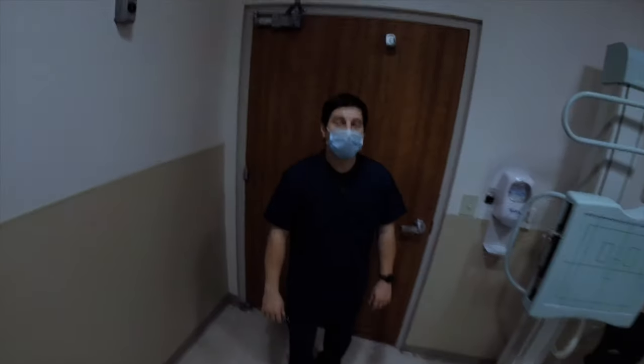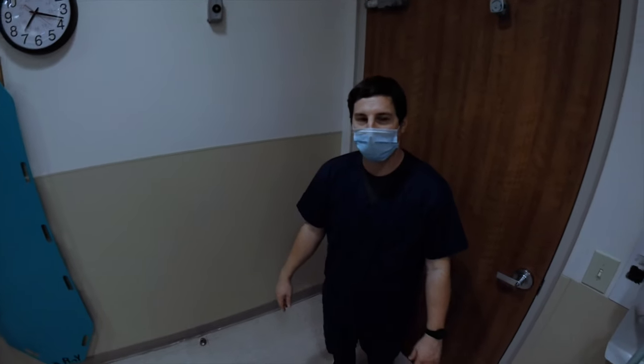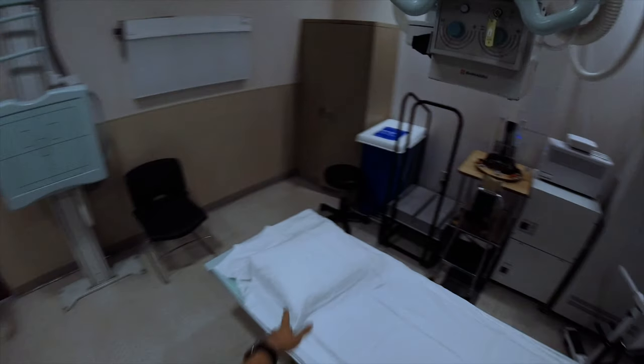My name is Ray, and I'll be taking x-rays. What brings you in today? My right hip. Right hip. For a couple days now. All right, cool. That's what we have here. So I have you on your back here. Head on the pillow, please.